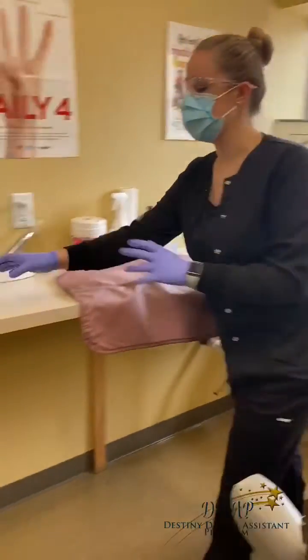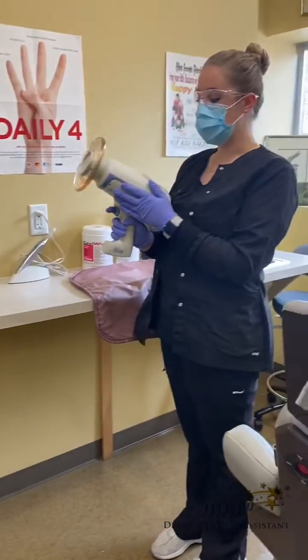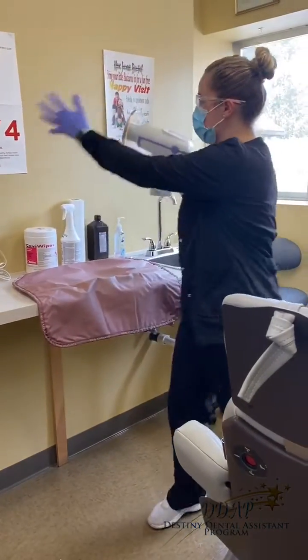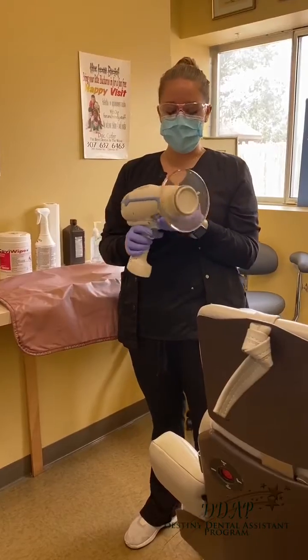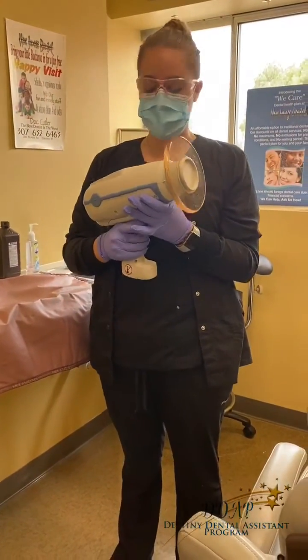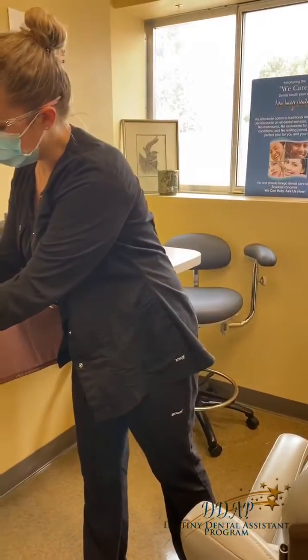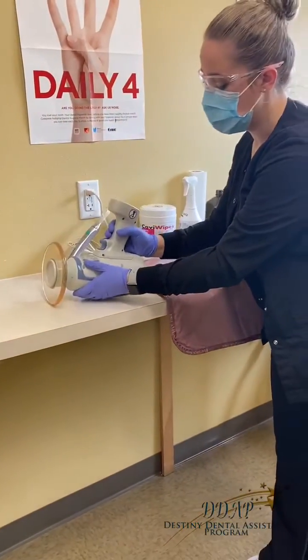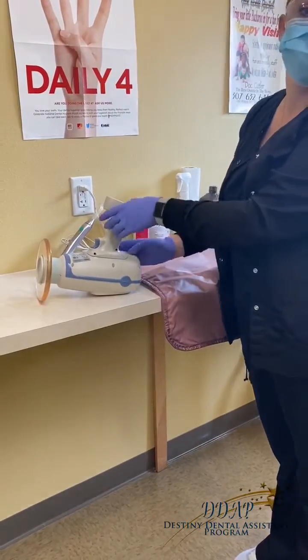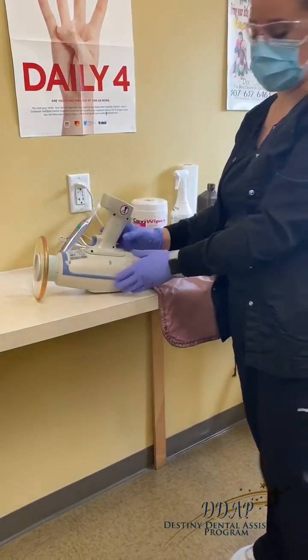This is a different type of x-ray equipment — it's different than the ones that you'll find in the other rooms that pull out on the side. This is called a Nomad. It's very important to be very careful with it, hold it correctly, and never place it down like this — you always want to place it upside down. It already has a sticker telling you that it should not be sprayed, so we will not spray this one.